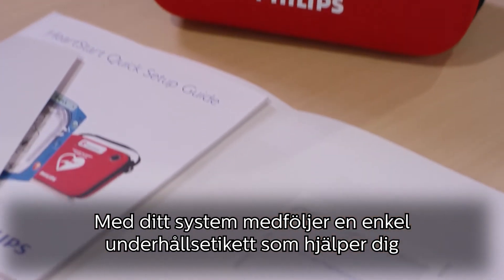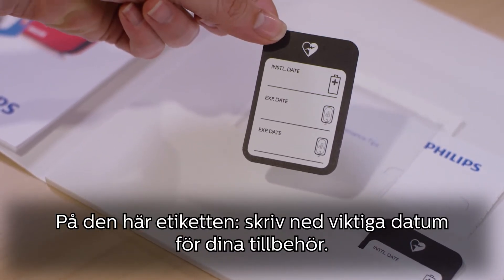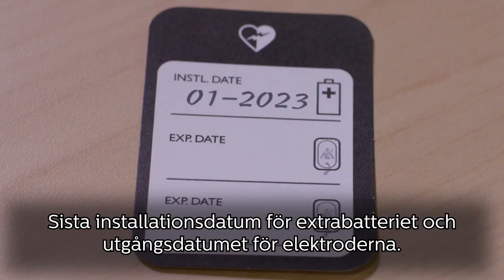Each system comes with a simple maintenance sticker to help you keep track of these two accessories. On this sticker, write down the key dates for your accessories: the install by date for your spare battery, and the expiration date for your pads.